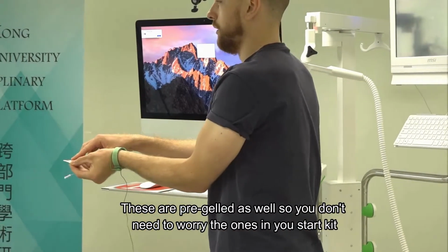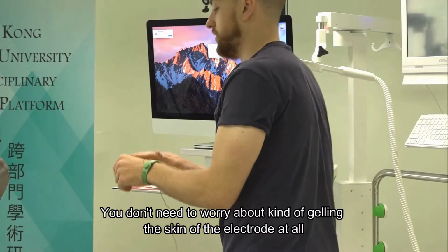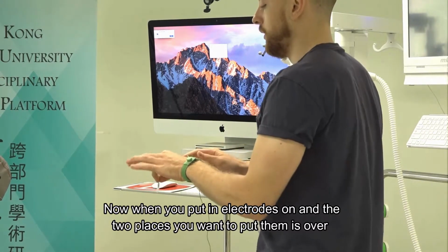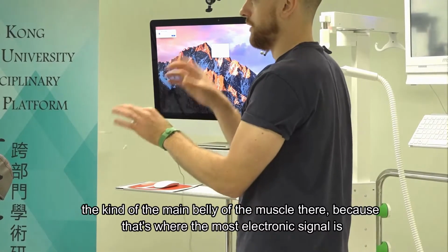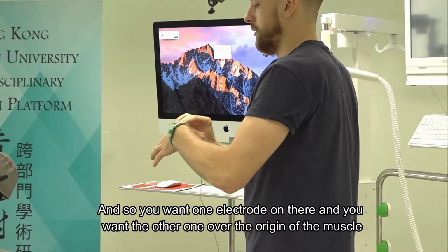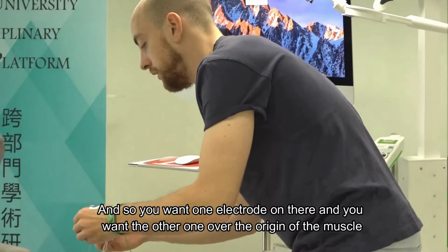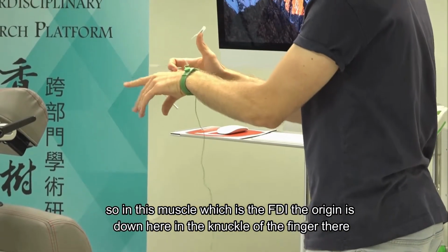These are pre-gelled as well, so you don't need to worry. The ones in your starter kit are, so you don't need to worry about gelling the skin or the electrode at all. Now when you put the electrodes on, the two places you want to put them is over the main belly of the muscle, because that's where the most electronic signal is. So you want one electrode on there, and you want the other one over the origin of the muscle. In this muscle, which is the FDI, the origin's down here in the knuckle of the finger.